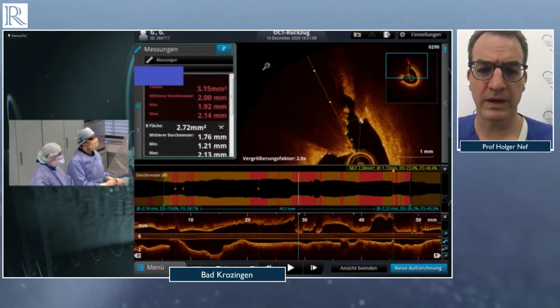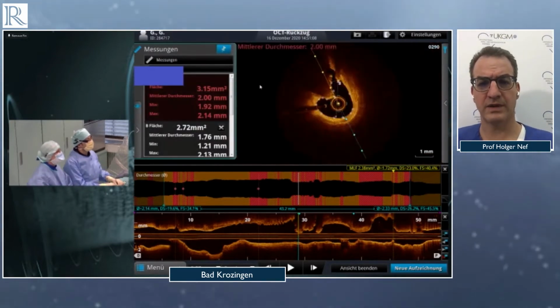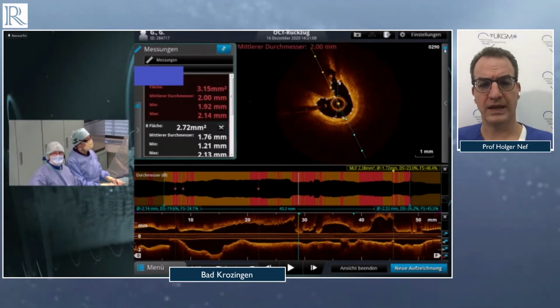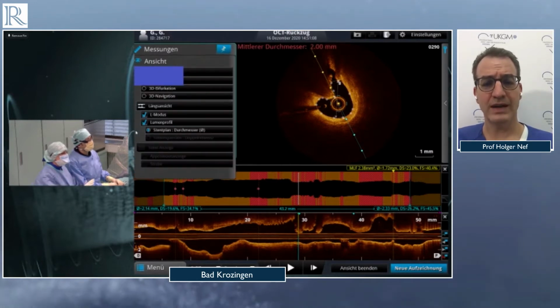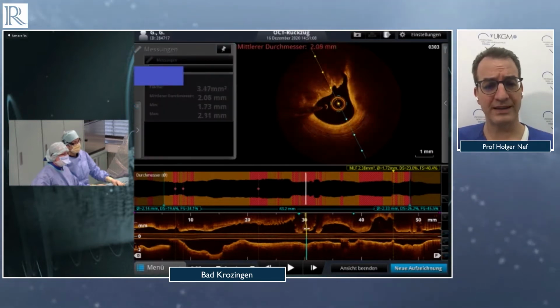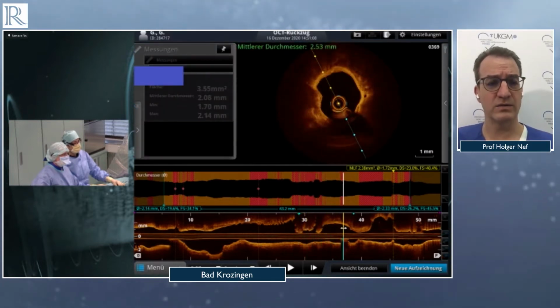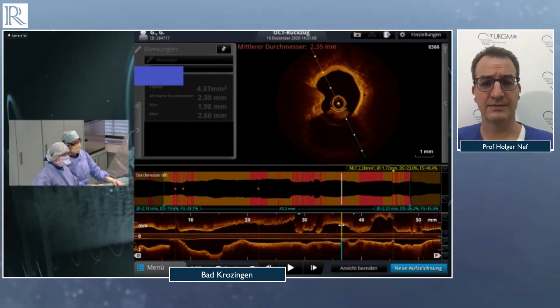That's a good argument, of course, because we have seen from the sub-analysis of CAD 1 and CAD 2 data that we can also tackle the eccentric lesion very well with lithotripsy. Well, if I look at the specific morphology of the plaque, the question is, do we think that this kind of calcified nodule is also a good target for lithotripsy as well?